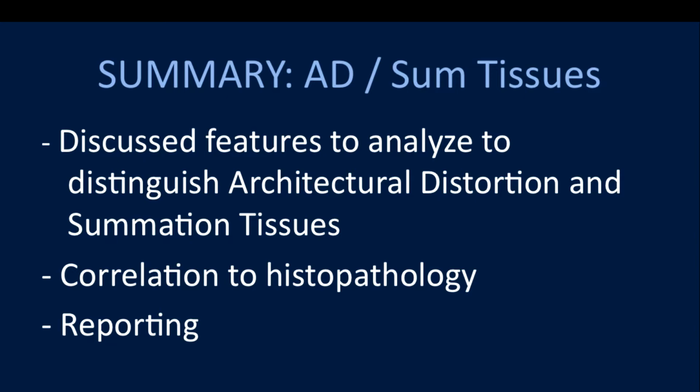I just want to throw out a thought that I'm not sure it's ever okay to put a BI-RADS 3 on a finding that you describe as even possible distortion. Let's say in the workup you're not seeing evidence of a distortion, then it begs the question, why are you bringing this patient back? Because you still have some degree of uncertainty. It's not that you think it's probably benign, you're uncertain if it's a real finding to begin with.